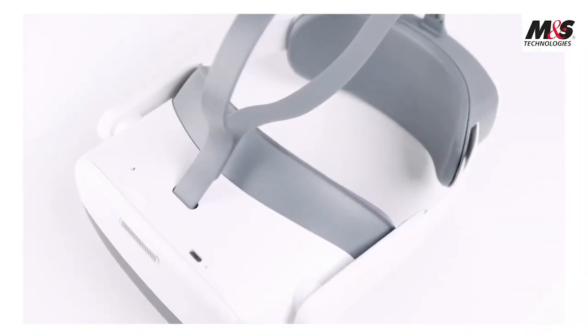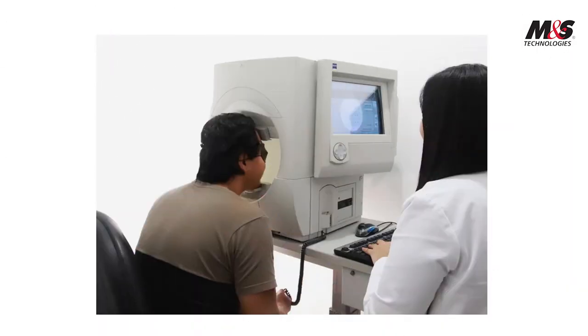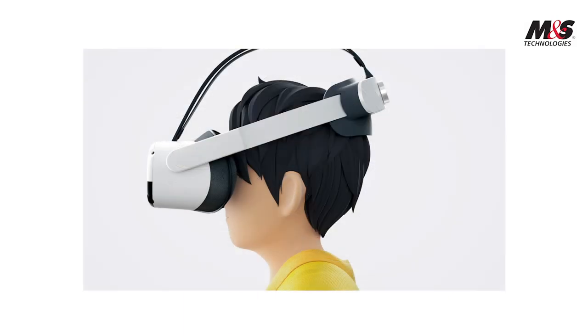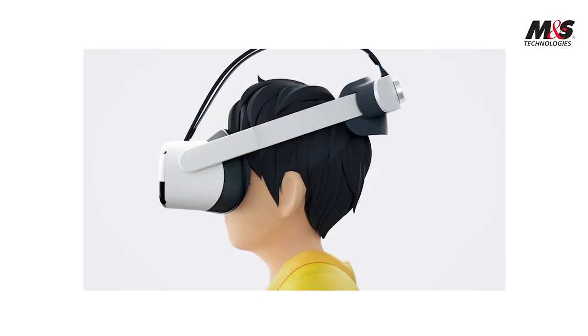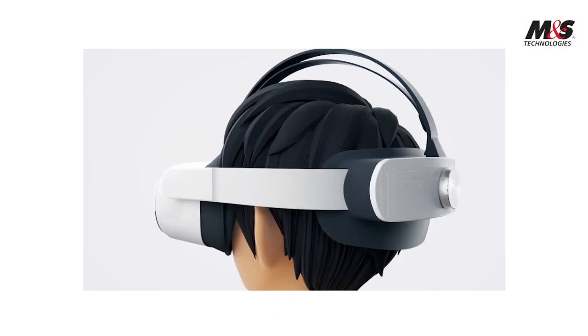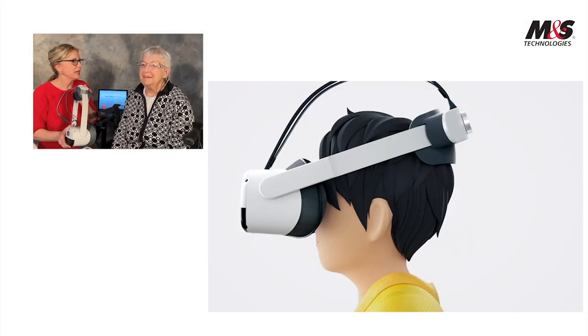Today you will be taking a visual field test while wearing a headset. If you've taken a visual field test before, the headset will be more comfortable, and the test may be faster than your previous experience. Although you may have never worn a headset, there is no cause for concern. Your doctor or technician will assist you to put on the headset, and you may wear your glasses for the test. I'm going to put the headset on.